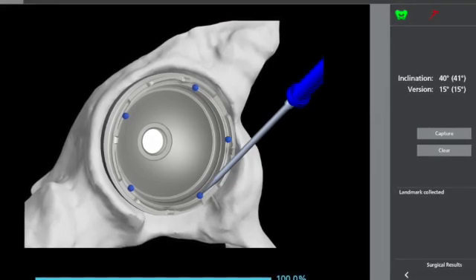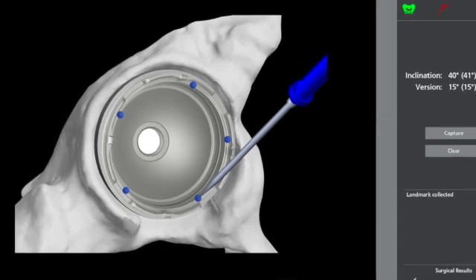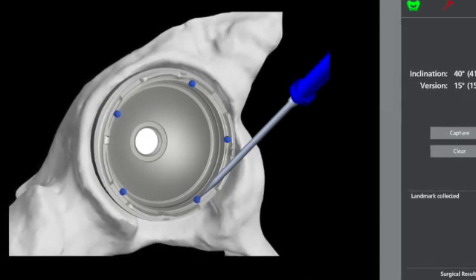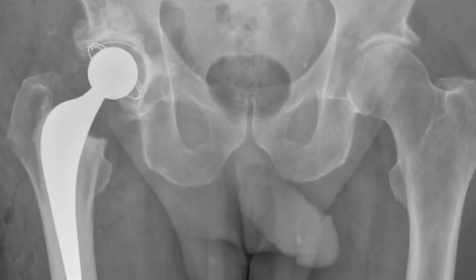You are then able to use a Howarth or a Bristow to change the position of the acetabular component and recheck it before the cement sets, and thus replicate the original surgical plan. And that's my off-label use of the Mako robot for cemented acetabular components.